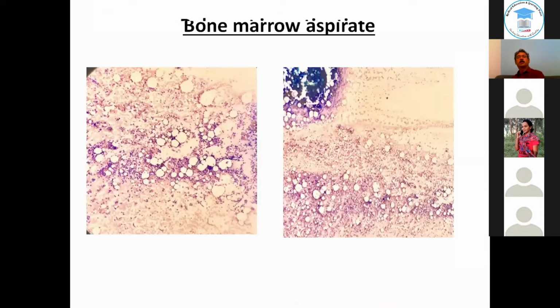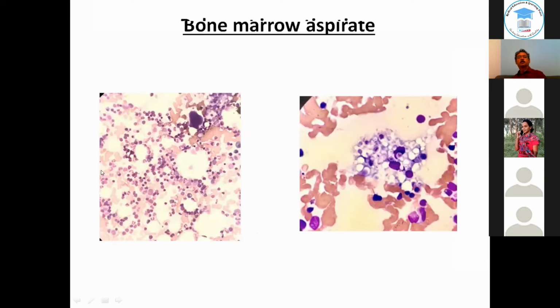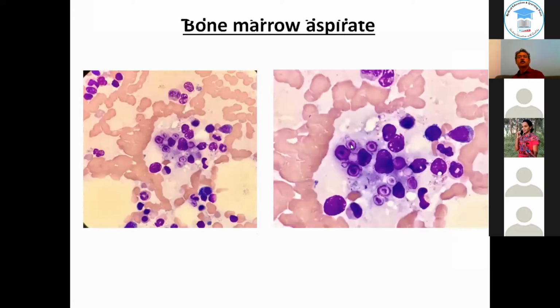And here's the aspirate, which looks fairly normal in both of them. Again, this looks fairly normal, but when you look at this higher part, you can see something out here, and it's difficult for me to figure out at this stage or at this magnification what we're looking at. But here, it should be obvious even to you that we are looking at yeast forms. So these are lymphocytes, obviously, these are RBCs, and these are yeast forms of what?